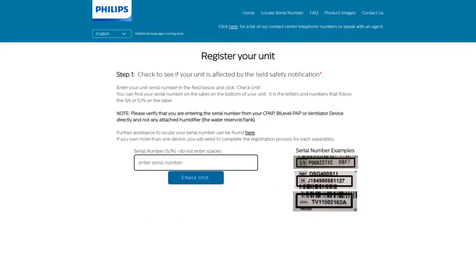In this video, we are showing how to find your serial number with a DreamStation CPAP device. You can also find information on how to find your serial number for your specific type of device on this registration page.